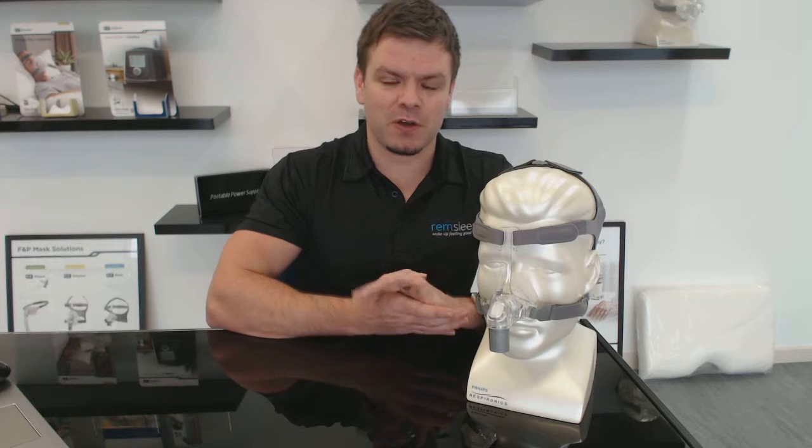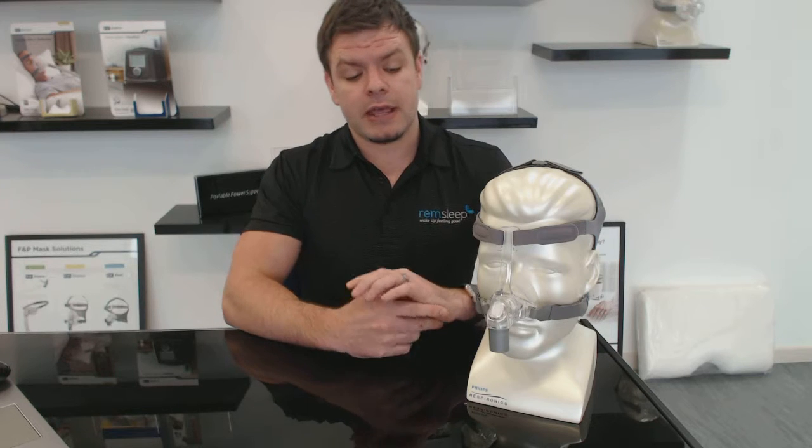G'day, Nick here from CPAPreviews.com.au. For those of you that don't know, we review CPAP masks, machines, and accessories so that you at home have a better idea as to what might work for you, and you can learn from our experience about the pros and cons of all the different bits and pieces on the market. Today we're going to take a look at the Fisher & Paykel Eson nasal mask — a nasal mask which just goes over the nose.